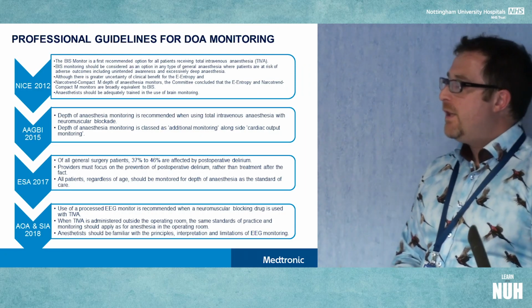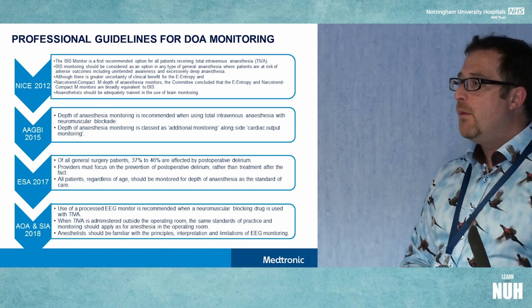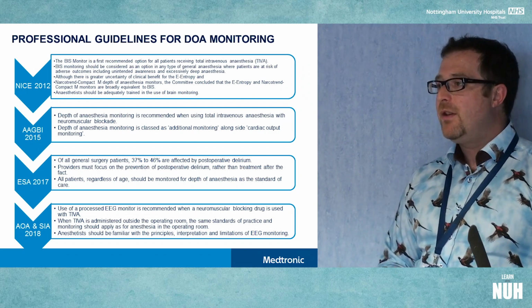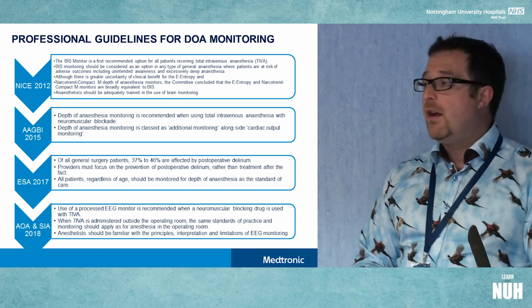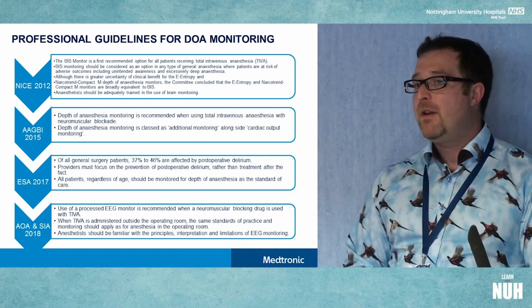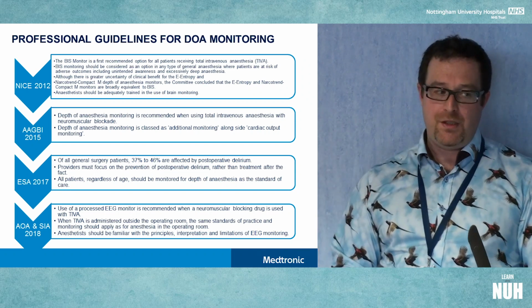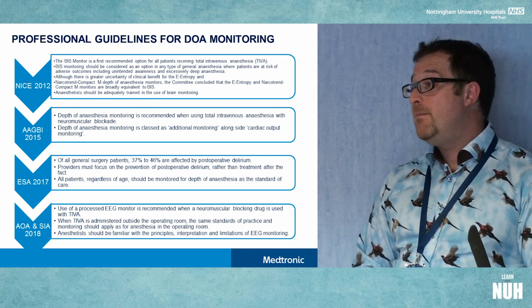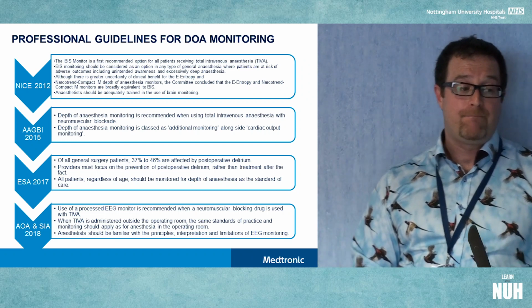So in terms of professional guidance, we know NICE suggested in 2012 that where you're using TIVA, particularly with a neuromuscular blocking agent, that BIS be considered as an option, and that all equivalent depth of anaesthesia monitors added to the mix in helping you titrate to balance your patient, but that anaesthetists should be adequately trained in interpreting BIS and applying what they find during the cases.